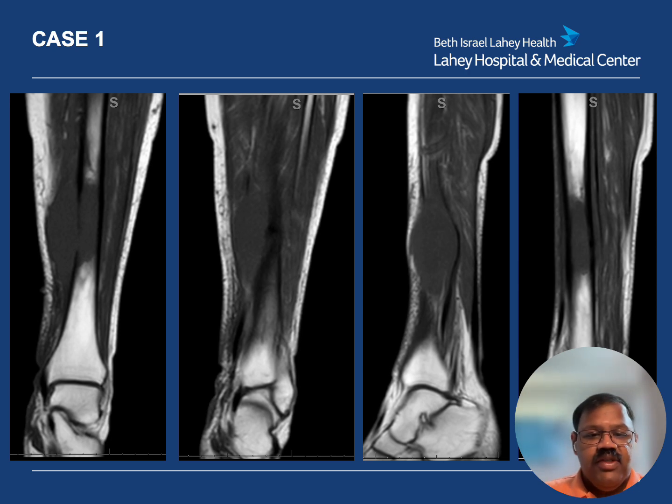You can see again that there is significant marrow replacement over the central portion of the diaphysis of the tibia, with loss of the medial cortex and a large soft tissue component that has then developed. The actual lesional tissue appears to be iso-intense to maybe slightly hypo-intense when compared to skeletal muscle, and appears to be well defined. I mean, it's certainly infiltrating, but you can see that there is clearly a distinct border between lesion and normal marrow elements. And this is better accentuated also on the sagittal views, where, again, the posterior cortex seems to be somewhat lost by this destructive and aggressive process.